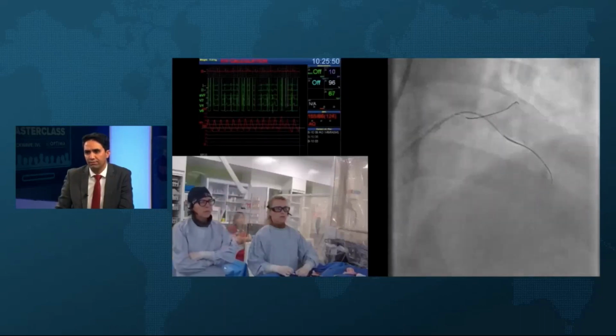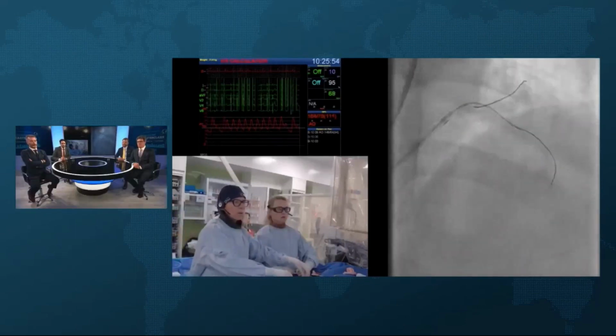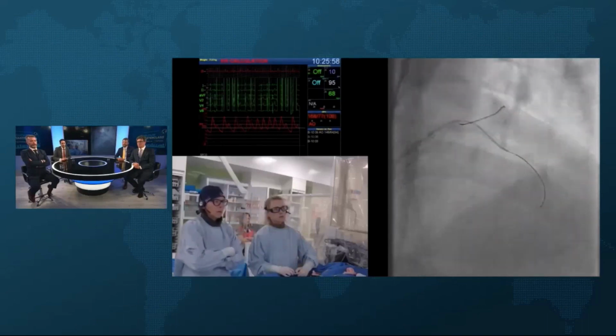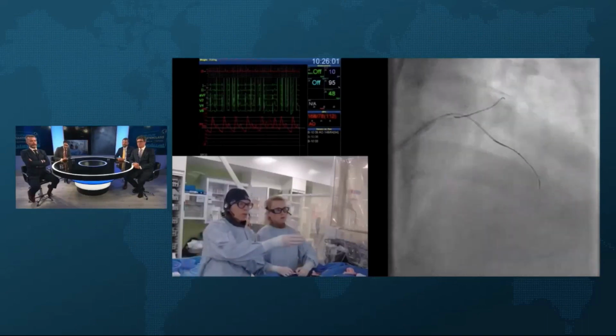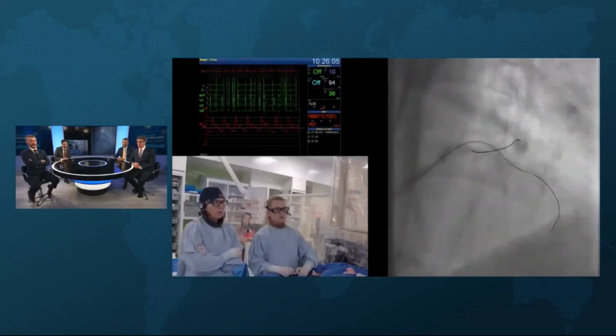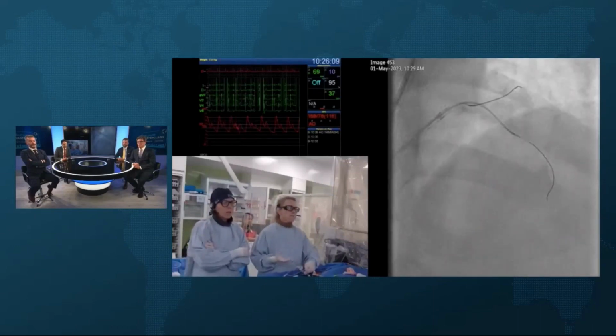There you go. Yeah. The only challenge with the Suo, I think, here is it's really tight, or you're maybe going out of that calcified lesion, that little aneurysm. Check, I think that's subintimal. Yeah, no, it's not subintimal, but it's out a small branch, I think. Yeah, but just take a look, just check it's okay, and then if it's okay. Yeah, I think it's out.